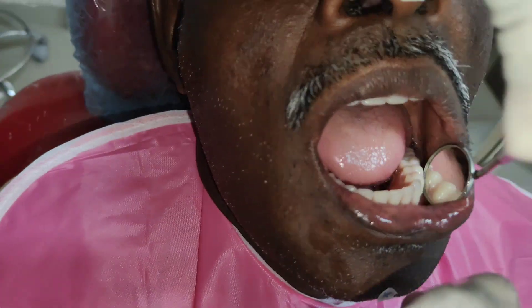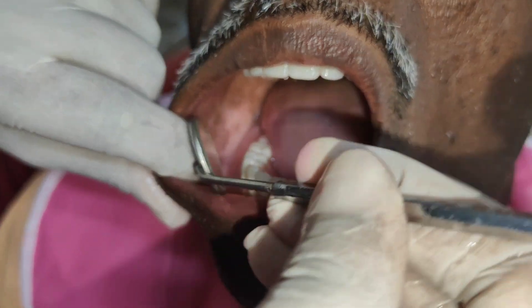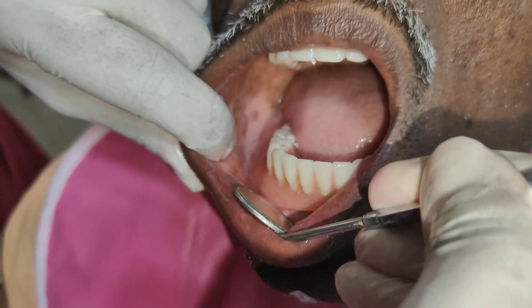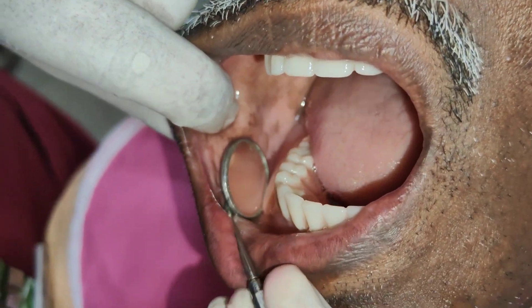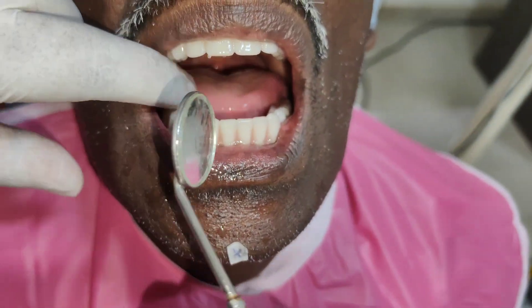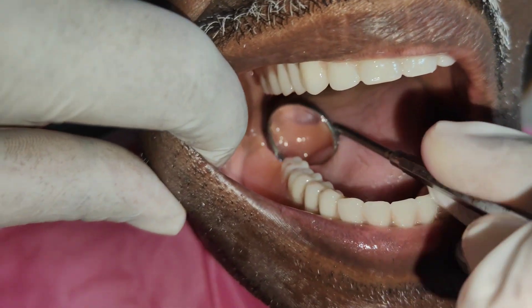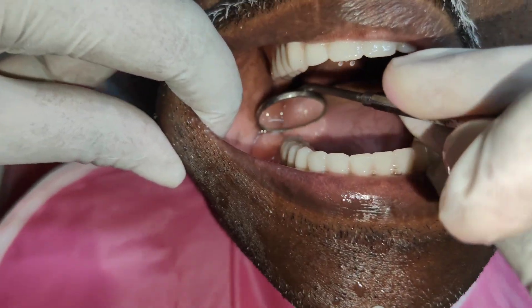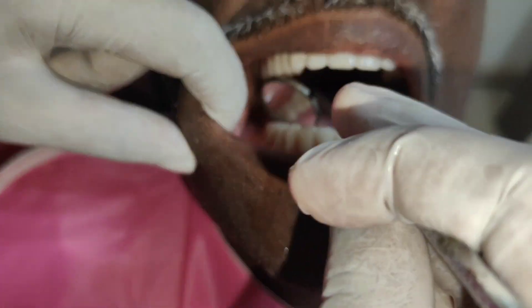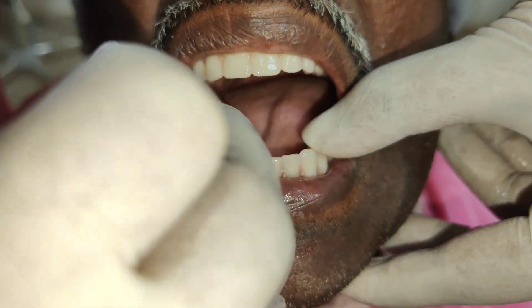After checking for peripheral adaptation on the buccal and labial sides, it should also be checked in the retromolar pad region. This is done by placing the mouth mirror at the junction between the denture base and the mucosa. There should not be any gap present between the denture base and the mucosa.